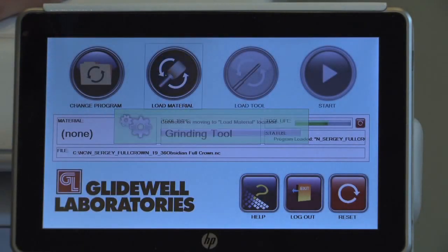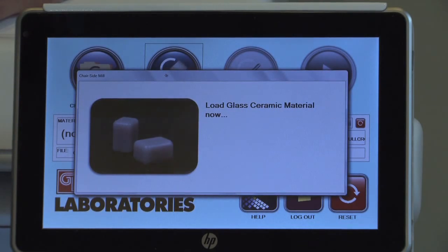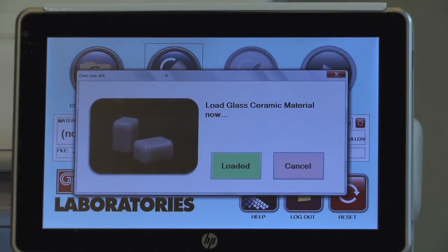Next, press the Load Material button and select the block to be milled. Be sure to use the material that was selected during the earlier case setup. Shade can be changed, but a different material will require a new milling file to be created in the IOS FastScan clinical system.